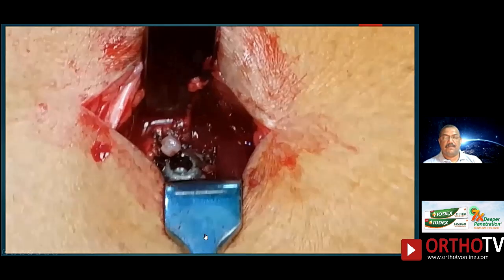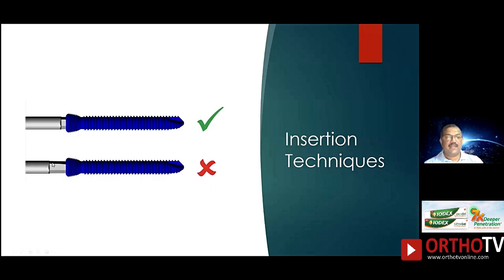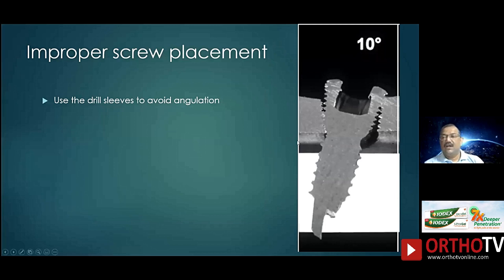When you are removing the screw, see to it that all the soft tissues around the screw are completely removed. This white fibrous knob is generally present inside the screw recess, and unless it is removed your screw head will not engage. The screwdriver should be completely going inside the screw head so that the recess is completely engaged, and only then attempt to remove. When inserting the screw in the locking configuration, ensure you don't get a cold weld — this happens if your screw is not at a perfect angle to the locking threads. Use proper instrumentation, especially the drill sleeve, and engage your head in the proper direction without changing the angle.